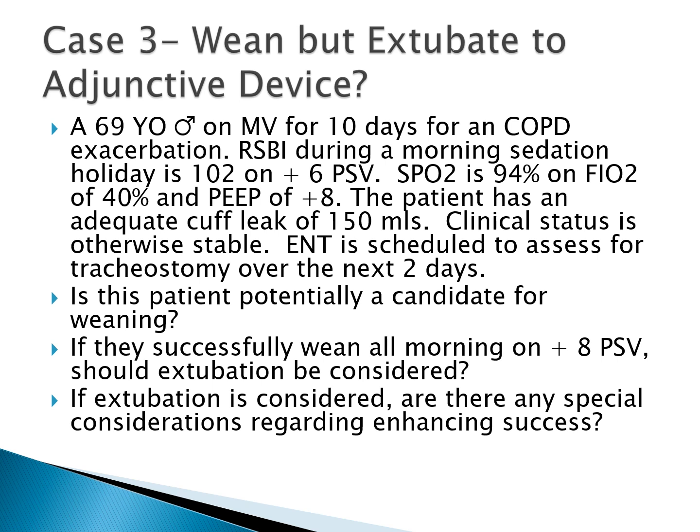The bottom line is, let's say I have a 7 tube in place versus an 8, which would be closer to ideal. In those cases, we'll actively wean patients on 8 or 10 of pressure support to overcome that additional resistance. However, in this case, I didn't say that.